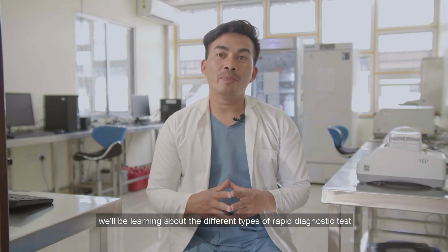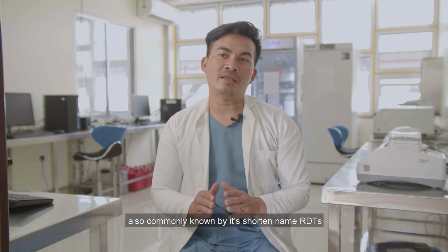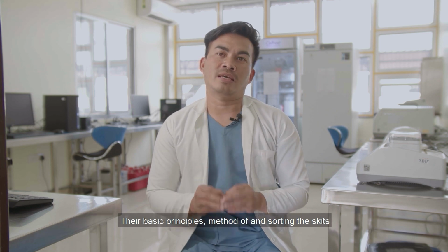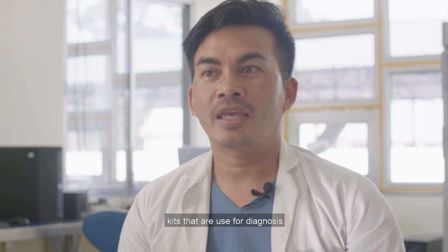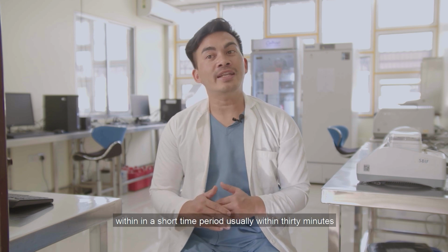In the following videos, we'll be learning about the different types of rapid diagnostic tests, also commonly known by the shortened name RDTs, their basic principle, and method of performing and sorting the kits. Rapid diagnostic tests are, as the name suggests, kits that are used for diagnosing infections or diseases within a short time period, usually within 30 minutes.